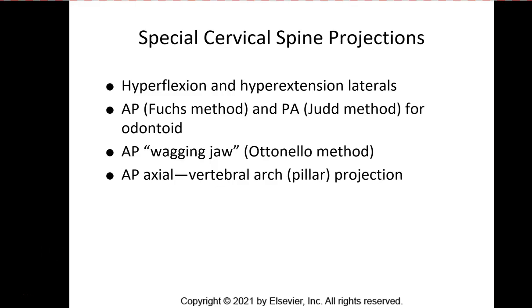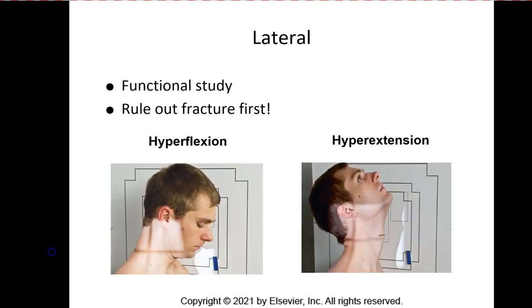Hello, and welcome to a brief discussion on special projections of the cervical spine. There are 4 special projections that we're going to discuss in this lecture. Some of them you may already see at clinicals, some of them may be new to you. So let's start by looking at flexion and extension laterals.